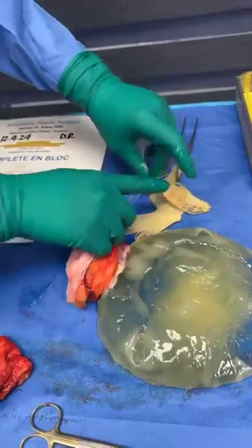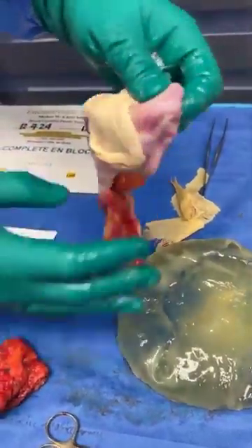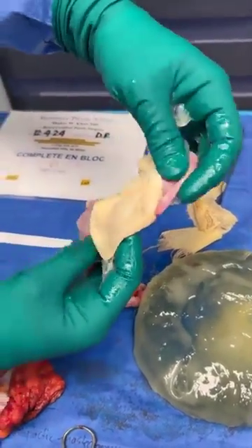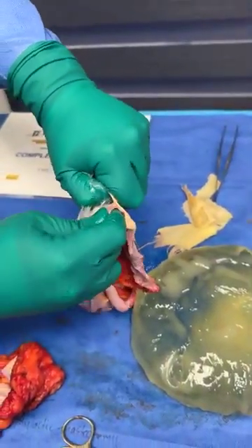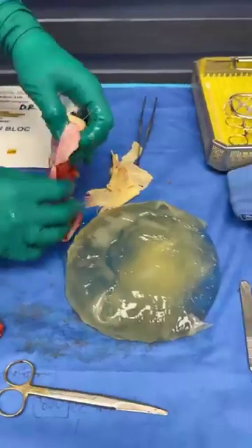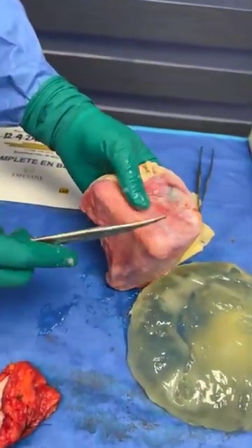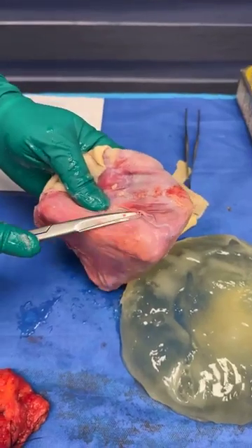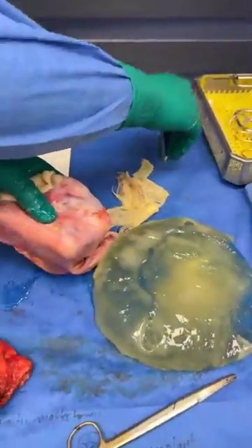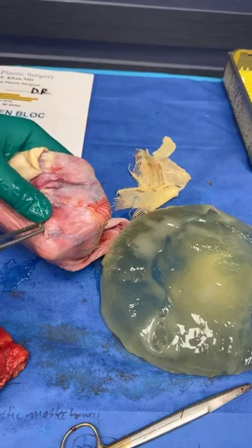We saw it on the other side. So you can see again the AlloDerm right here. Look again at the hair follicles within, and this is like a nice piece, very expensive AlloDerm. I'm going to send it along with the capsule. So as you can see, I just want to go ahead and also highlight. Look at this one. Look at this green Ethibond suture. I don't like a braided suture. Imagine this is right next to cheese, if you will, and it's going to cut right through it, right?